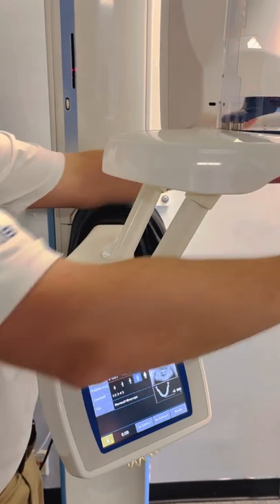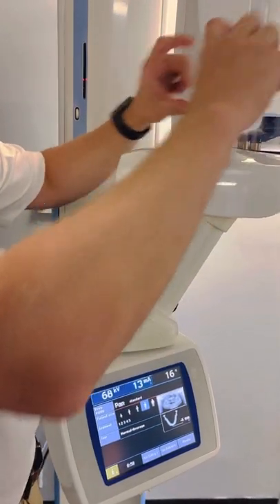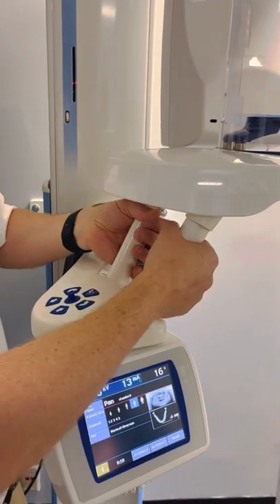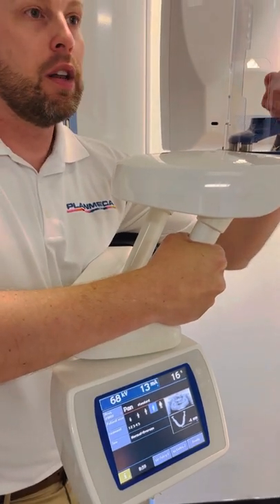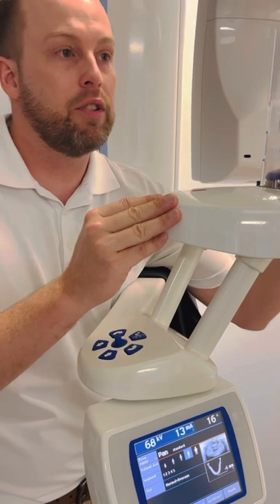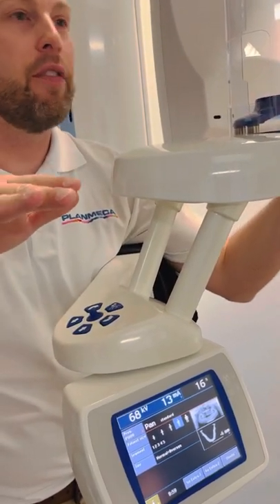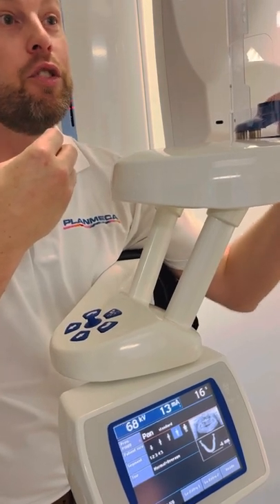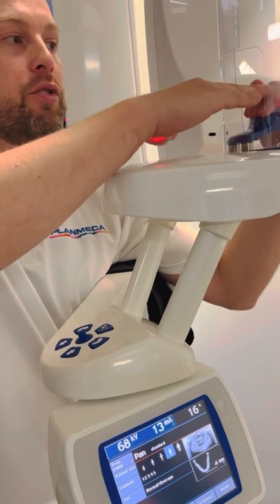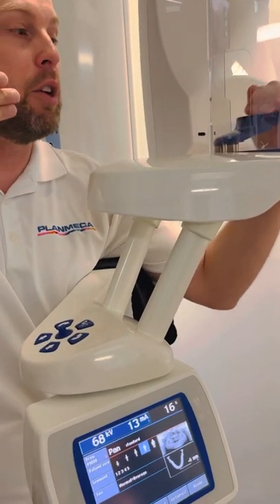Guide the patient in — first have them use the handlebars. By the time they put their chin in the bite stick or chin cup, their eyes are up here and they can't see below where their hands go. So guide the hands first, then guide them into the chin cup so they rest their chin in it. Some patients won't completely understand where their chin goes and will rest it on top — guide them back into the trough. In rare cases they'll try to bite it. If they rest on top, they'll be too far forward and the machine can't image the front — it'll cone cut the front part of the CT. Make sure they're in the trough.